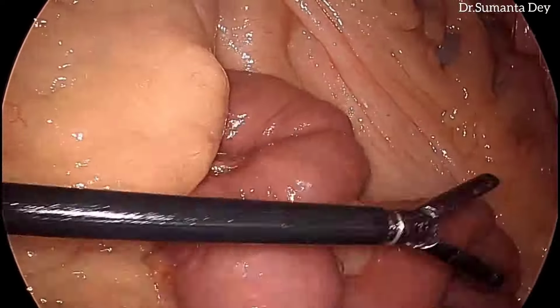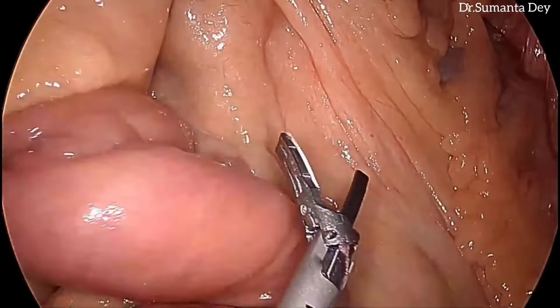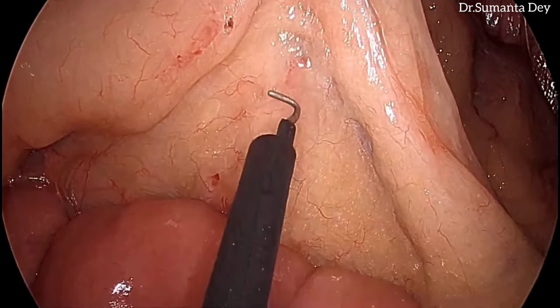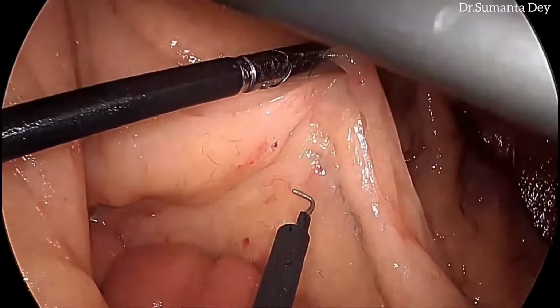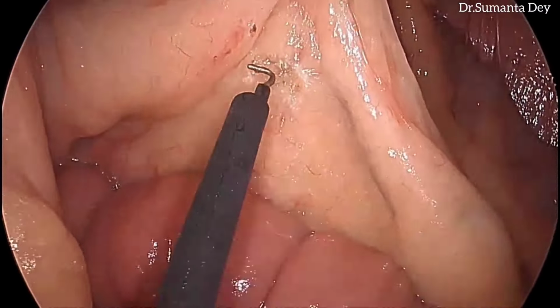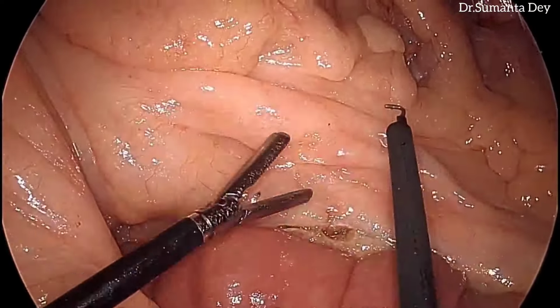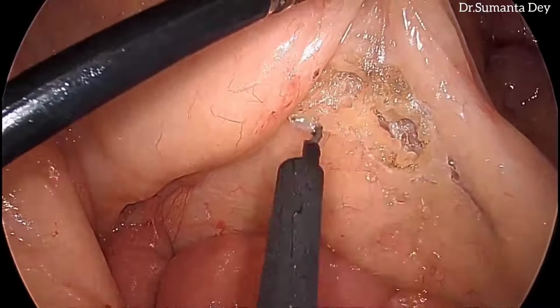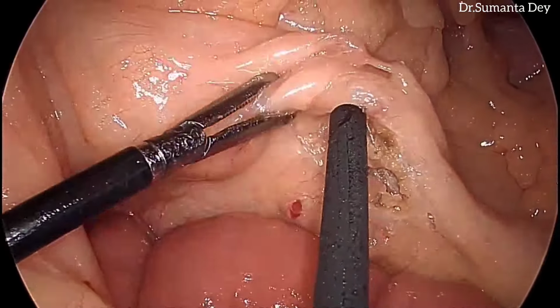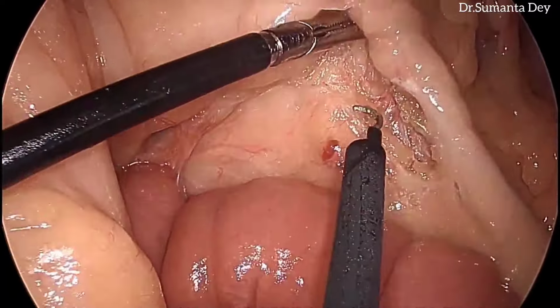So my plan is to go ahead and do a segmental colectomy with complete mesocolic excision with central vascular ligation. After retracting the transverse colon, the fold of the inferior mesenteric vein near the ligament of Treitz is identified and reflected, and just below the inferior mesenteric vein a peritoneal incision was given.